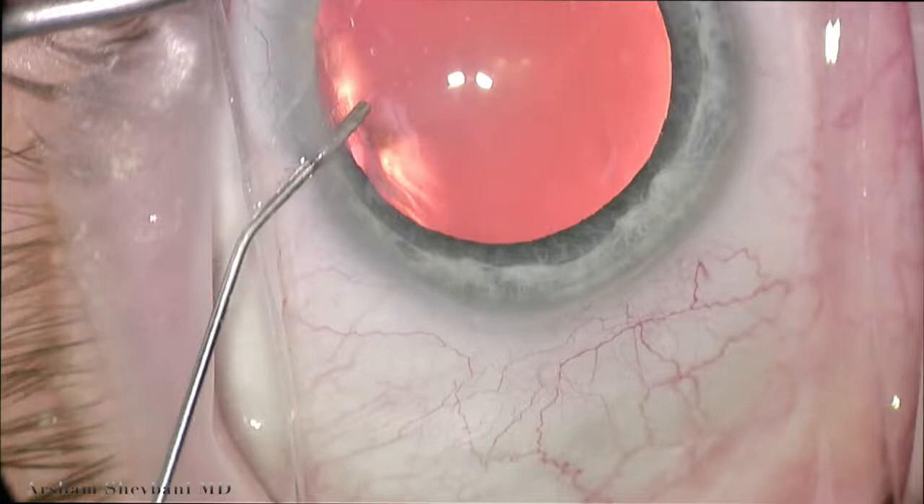Hi, I'm Arsham Shabani, anterior segment and glaucoma surgeon at Washington University in St. Louis. We'll be demonstrating the use of the disposable gonioprism from Katena here.